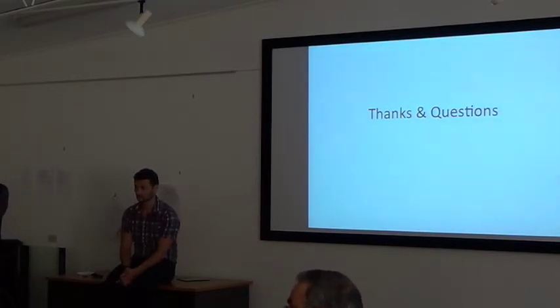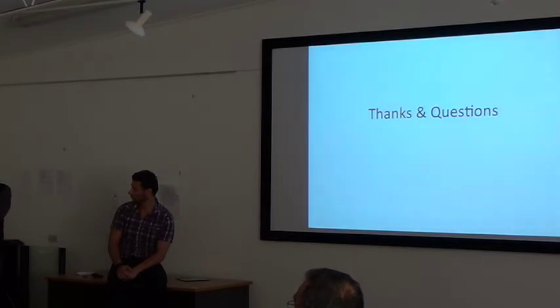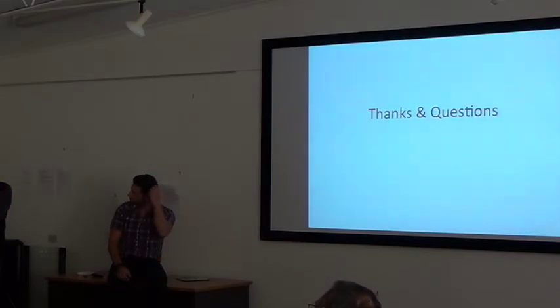Did you have a question? I was going to ask about spatial resolution. How small can you get a box? Ideally, 2 cm by 2 cm by 2 cm gives you a decent spectroscopy. You can push it as small as you can, but you really push the limit of doing the shimming of the scanners, and if it's too small, you get very little signal to sample. As I talked about, you're dealing with something like millimoles per liter. So if you think 1 centimeter by 1 centimeter, I think that would be very limited.